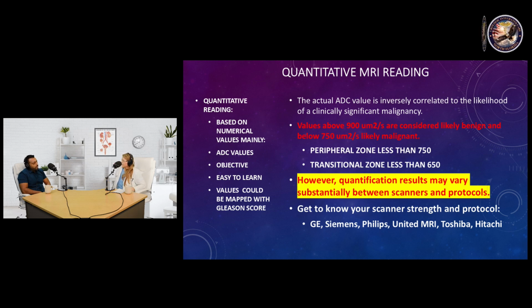What do you think, Manish? Well, I wanted to ask you actually on this. This is impressive, right? That you've been able to identify this from your patients. But how long in the beginning, when you first started to adopt MRI, how did you get to understand that these are the ADC values I need to look for? Did you reach out to radiologists, or how did you figure this out? I have a very excellent mentor.